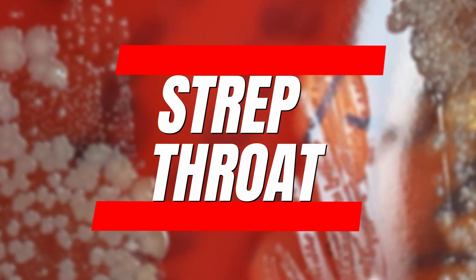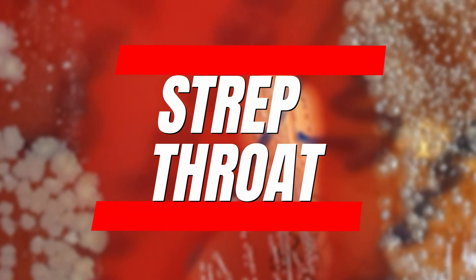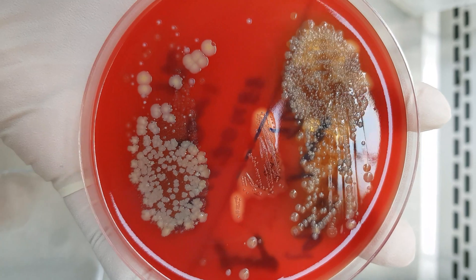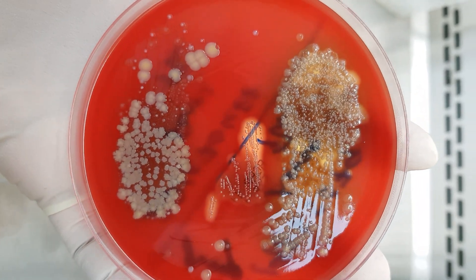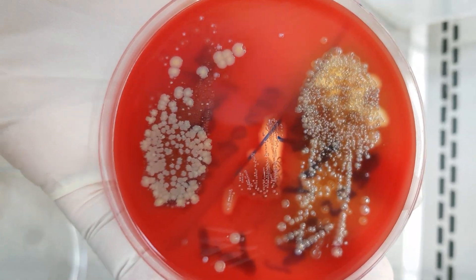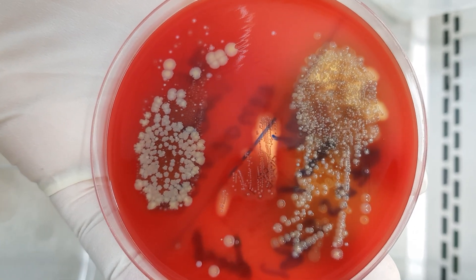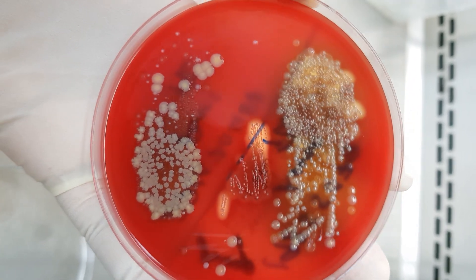A swab of the throat may be collected from a patient presenting with a sore throat and cultured onto blood agar, chocolate blood agar, and MacConkey agar for identification procedures and antibiotic sensitivity tests.